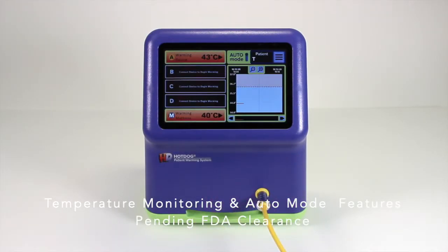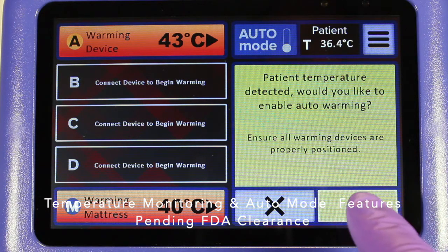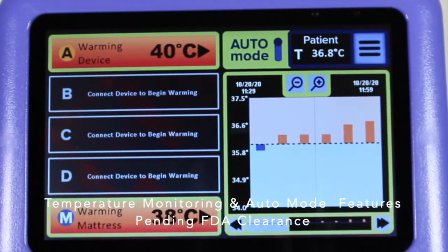The WC7X controllers offer automatic control of warming device temperature settings based on the patient's core body temperature. This feature is only available when using the properly keyed cable and temperature probes.